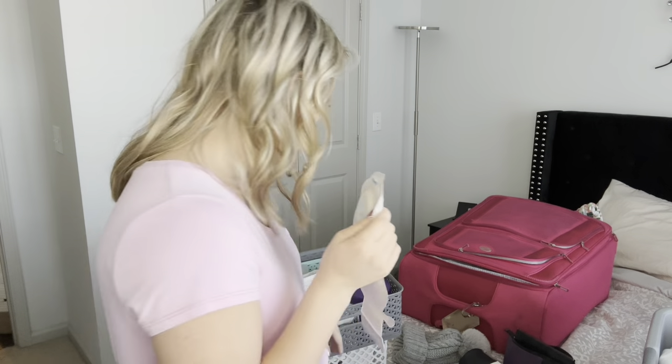I love these Coloplast SenSura Mio bags because this material dries a lot faster compared to when I've used Hollister bags before. If I'm going to be doing any vacation in the ocean or where swimming or water is involved, I can get out of the pool, towel off, and within a couple minutes it's already dry — it doesn't feel like a wet yucky thing sitting on your abdomen. I use the Coloplast SenSura Mio 16706.